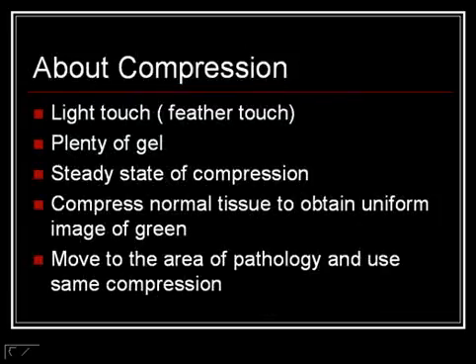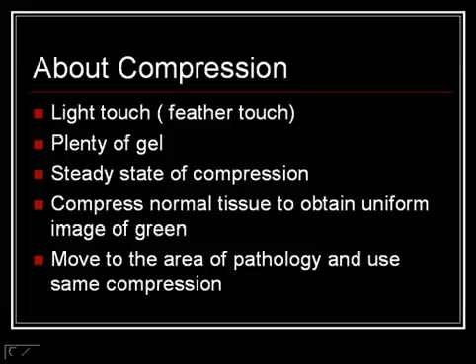When the compression is being applied, it is very important that it is applied with a very light touch. I refer to it as a feather touch. You need to use a lot of gel. There has to be a steady compression, and the compression of normal tissue is necessary to obtain the uniform image of the green. Then the area of pathology is investigated using the same compression.